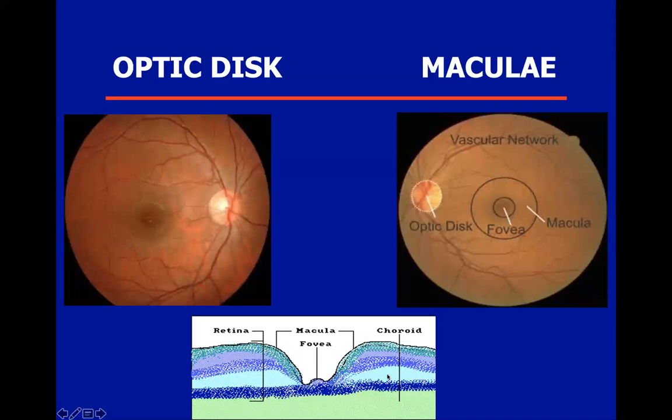This is just a drawing. It's actually from an OCT. You're going to be hearing me talk about that. When I talk about OCT, it's optical coherence tomography. If you think of the MRI, where it takes slices of the brain, the OCT takes slices of your retina. And this is what you're seeing here.